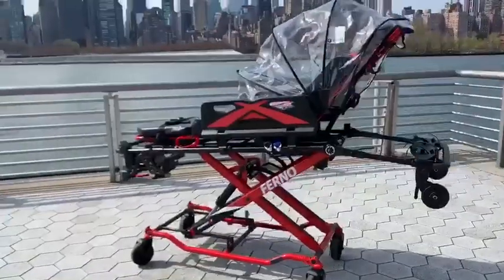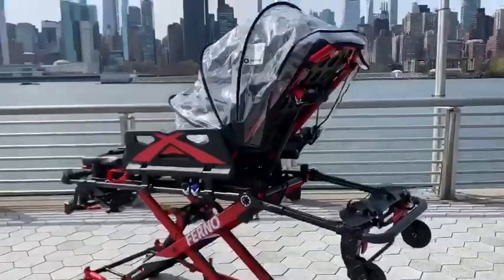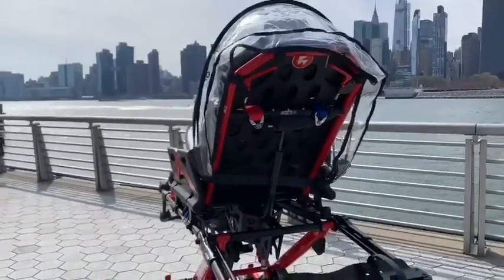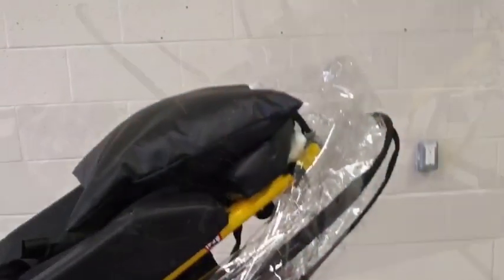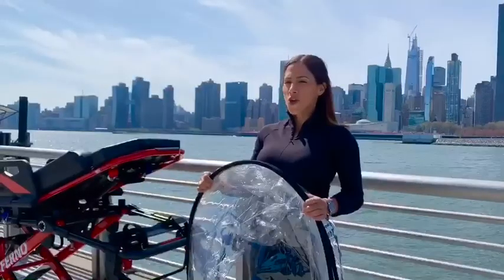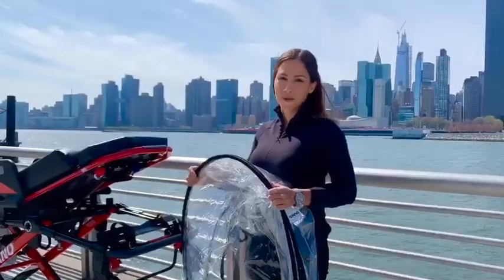This clear acrylic shield helps minimize the transfer of pathogens between patients and medics, equipment, and the environment. It works with almost every cot on the market. Now let me show you how you attach it to the cot and how it works.